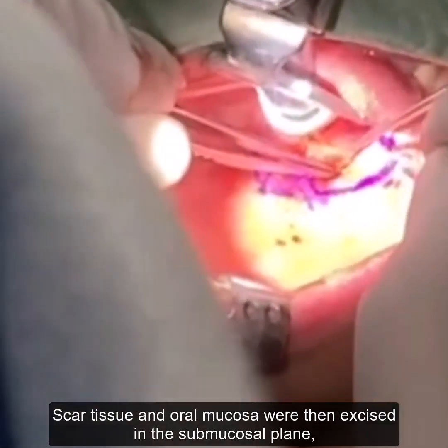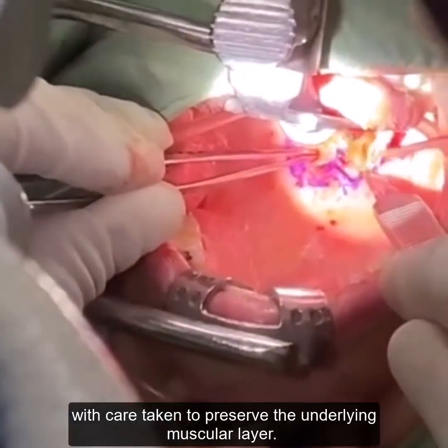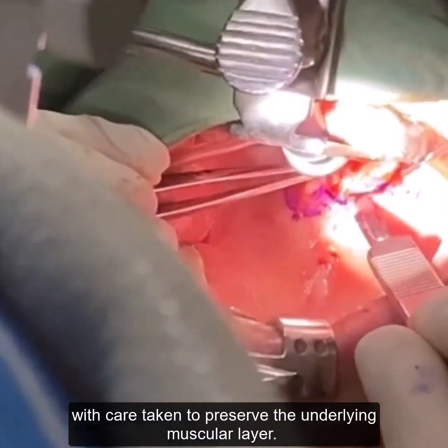Scar tissue and oral mucosa were then excised in the submucosal plane, with care taken to preserve the underlying muscular layer.